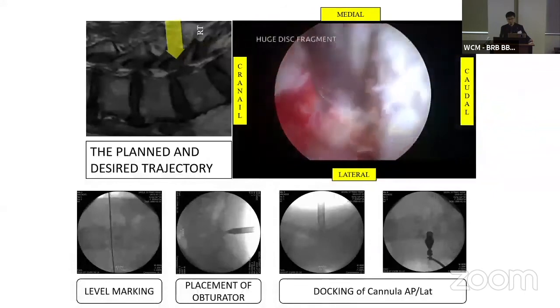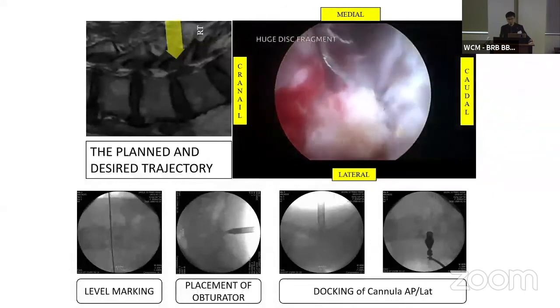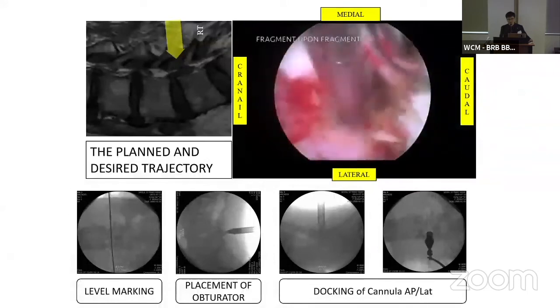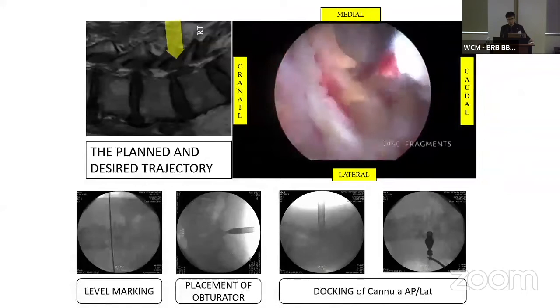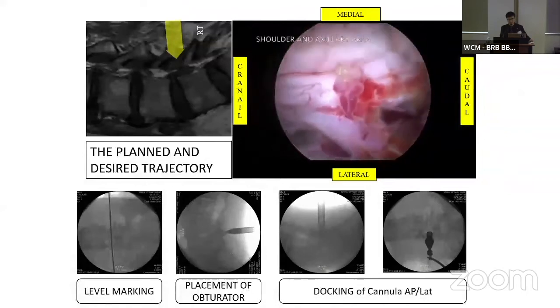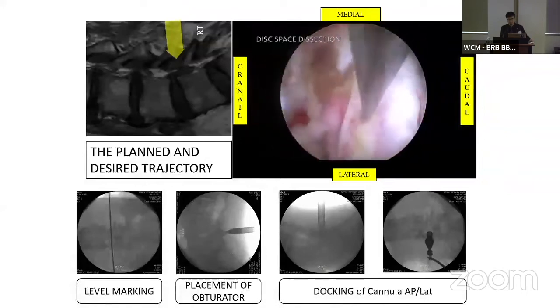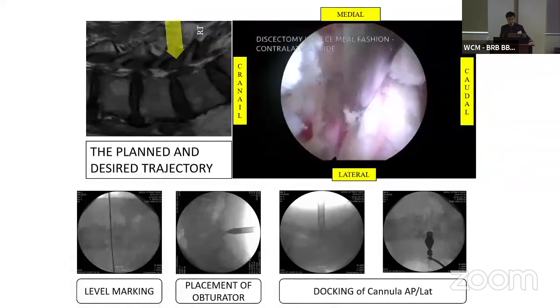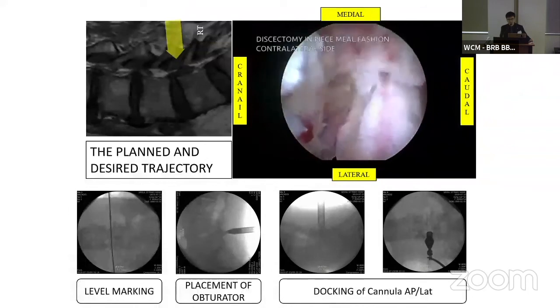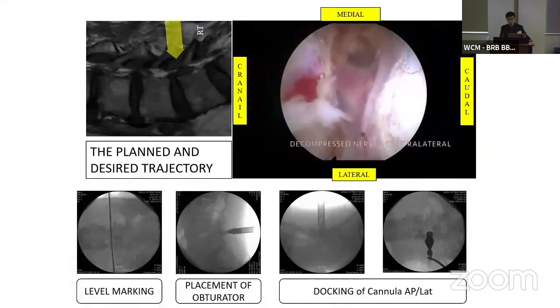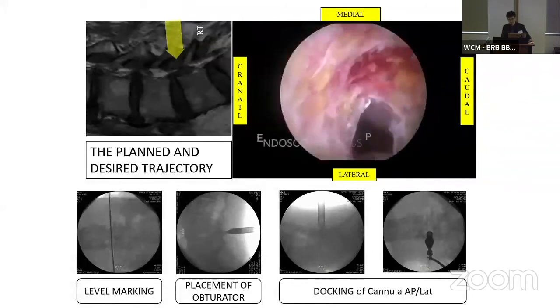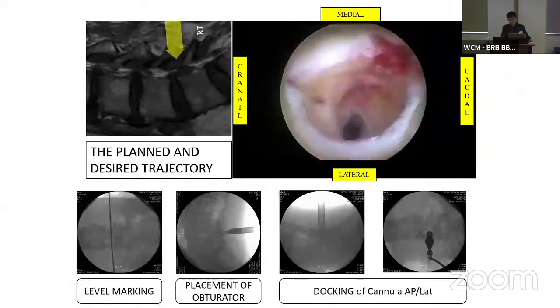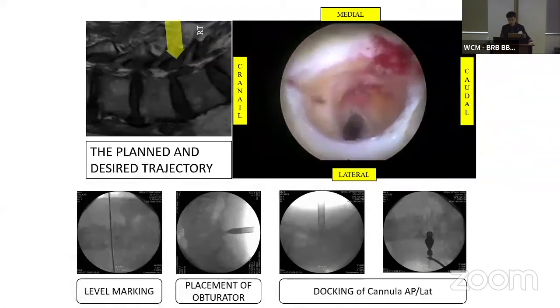There is the axilla portion because the patient has ipsilateral disc herniation. With the small scope, we can retrieve the ipsilateral disc herniation from the ipsilateral side. And then we can move to the contralateral side. We can also see the contralateral axilla portion. Finally, we completely removed the disc herniation and released both ipsilateral and contralateral nerve roots completely.